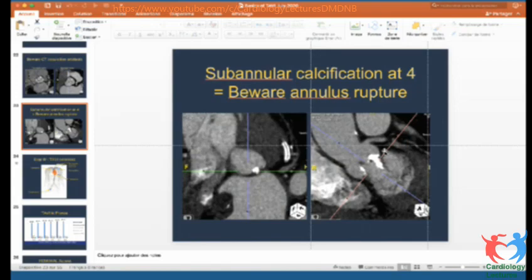Well, yes. If you have a small volume center, you have to begin with one valve. I could do another presentation on this, but usually with one valve you can treat, I think, more than 80% of your patients. Sometimes you have a very big annulus. With a big annulus, especially if they are calcified, it would be more suitable for the Sapien 3, 29 Sapien 3. If you have a valve not very calcified, and especially if your annulus is small, about 20-21 millimeter in a very old lady, it would be more suitable for the self-expandable.